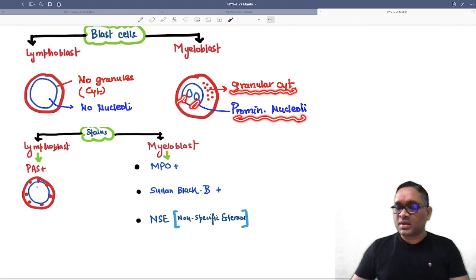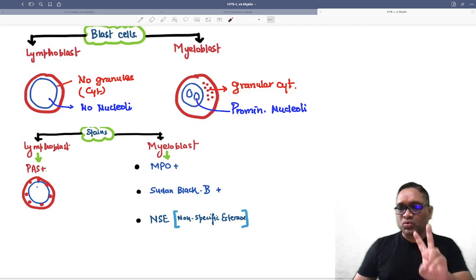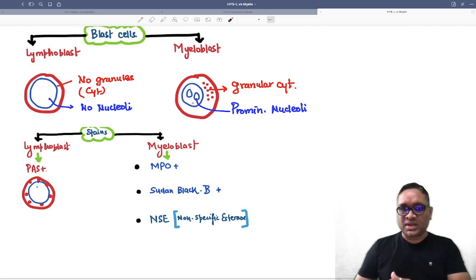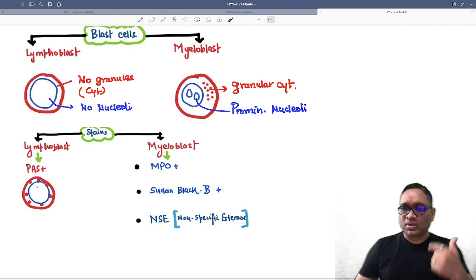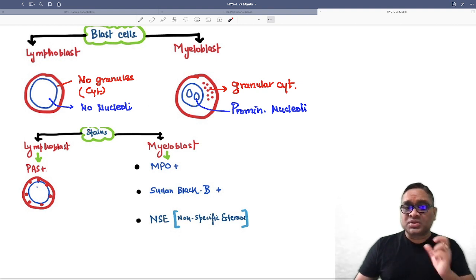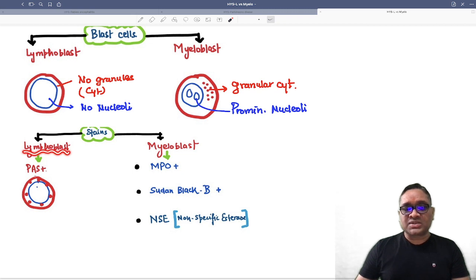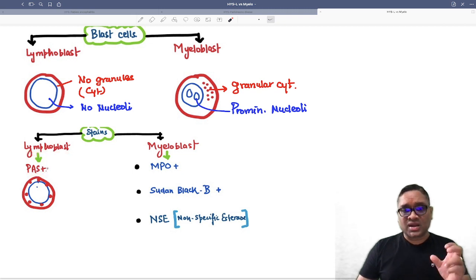As you can see here, these are the two key points: granular cytoplasm and prominent nucleoli for myeloblast, and no granules and no nucleoli for lymphoblast. Now we can also use cytochemical stains to differentiate them.